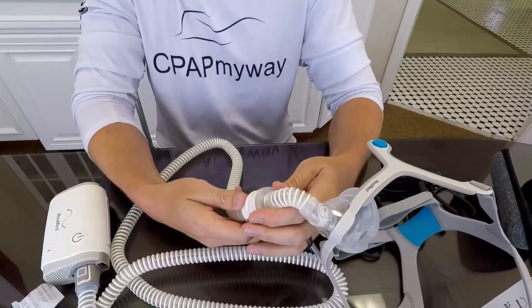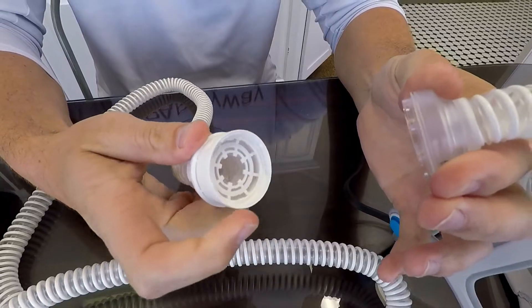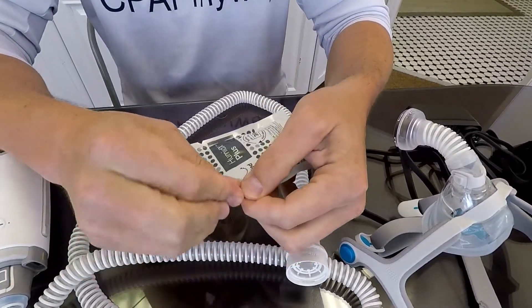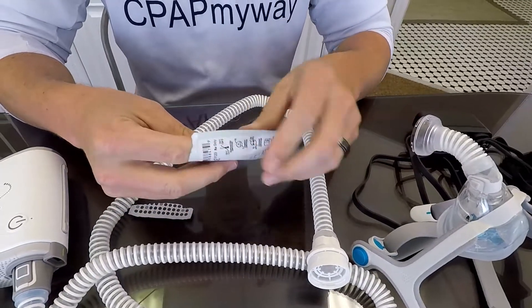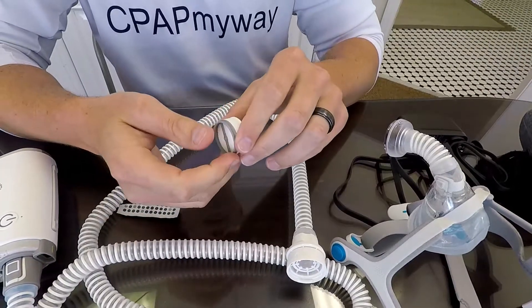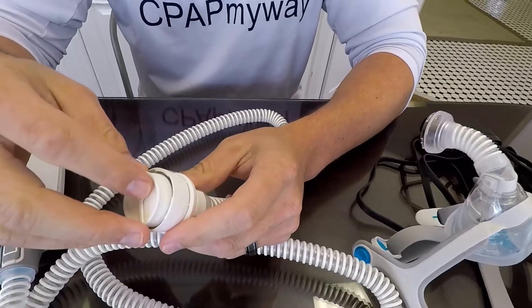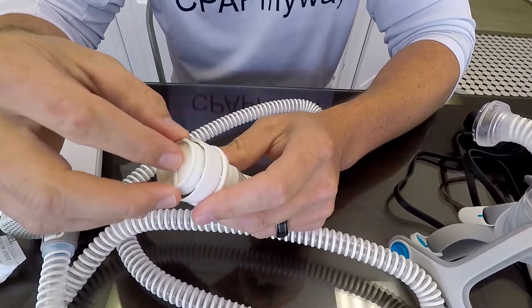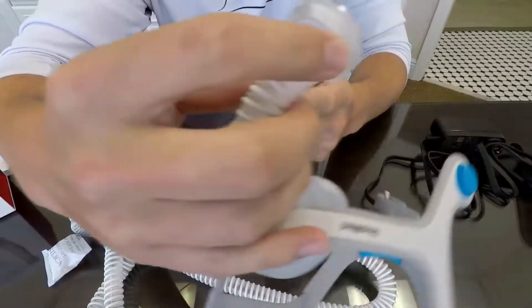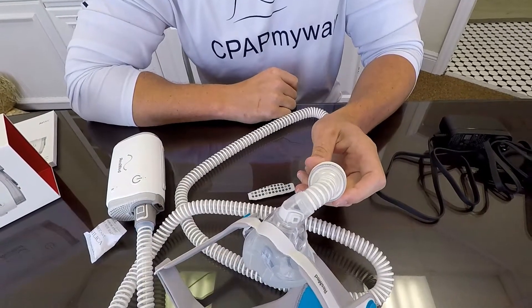This is where you install the HME. Give the clear plastic part a little twist and it'll pop loose from the white plastic, giving you a little open cavity. That is where you put your heat moisture exchanger — HME, or in ResMed terminology, Humidex. The colored side goes down; you'll even hear it clip in — it has a little groove so it doesn't fall out easily. Once that's in, put your top back on and twist it to the right to lock it back into place.